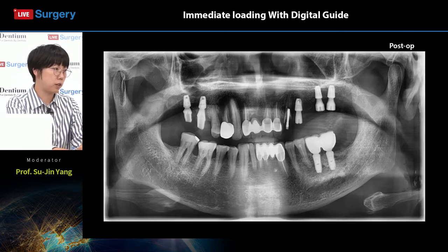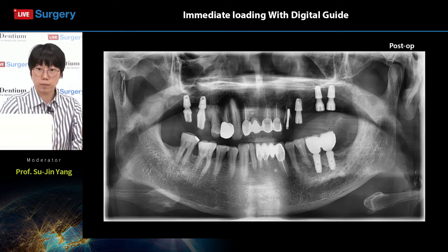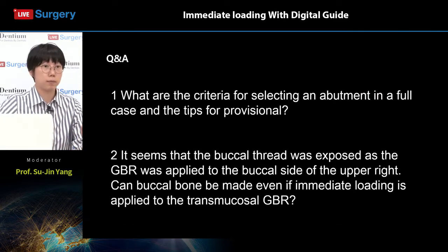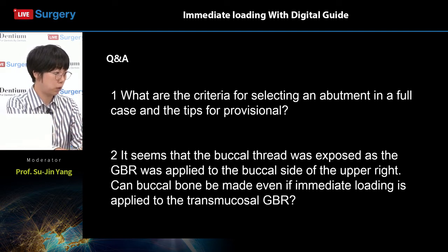So for instance, if you have placed, say, 8 implants on one arch, but could only achieve stability in 4, say maybe 2 molar or premolar areas on each part of the arch, then the abutments can be secured on only these areas. You don't want abutments on other implants that didn't have enough initial support stability.